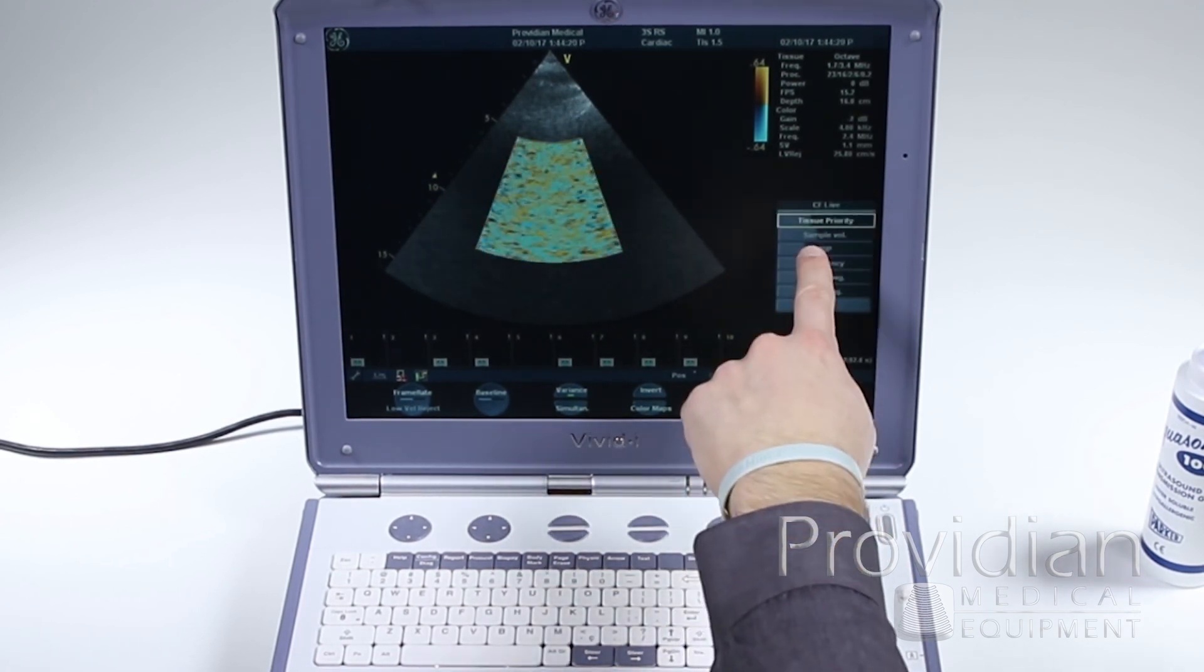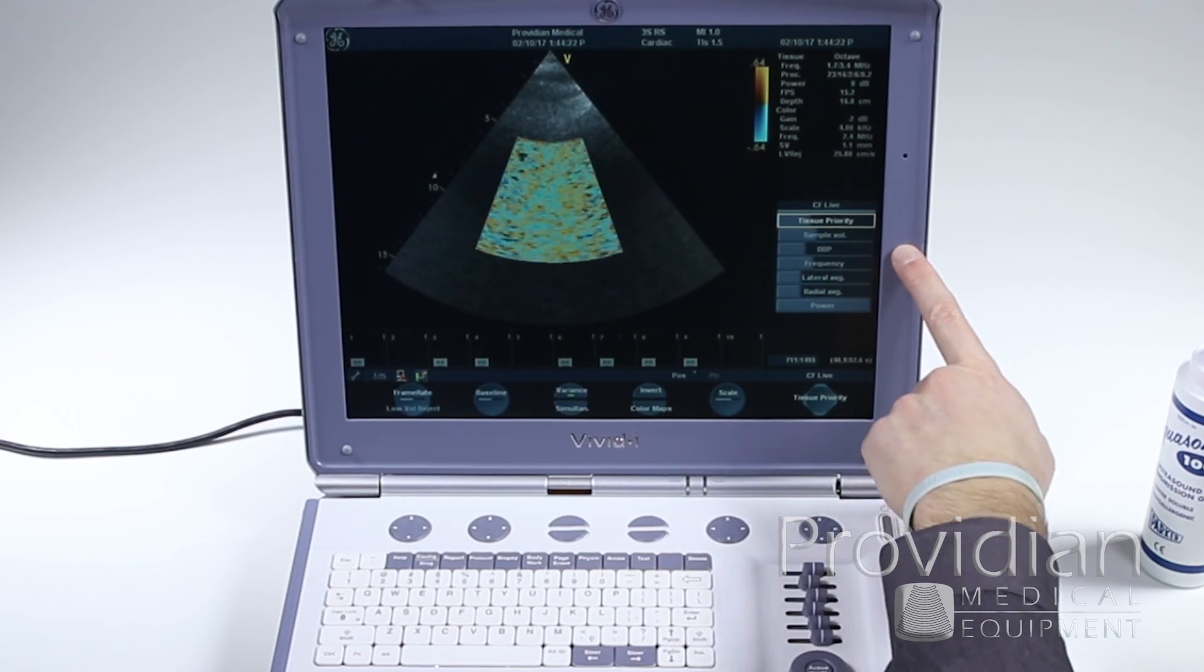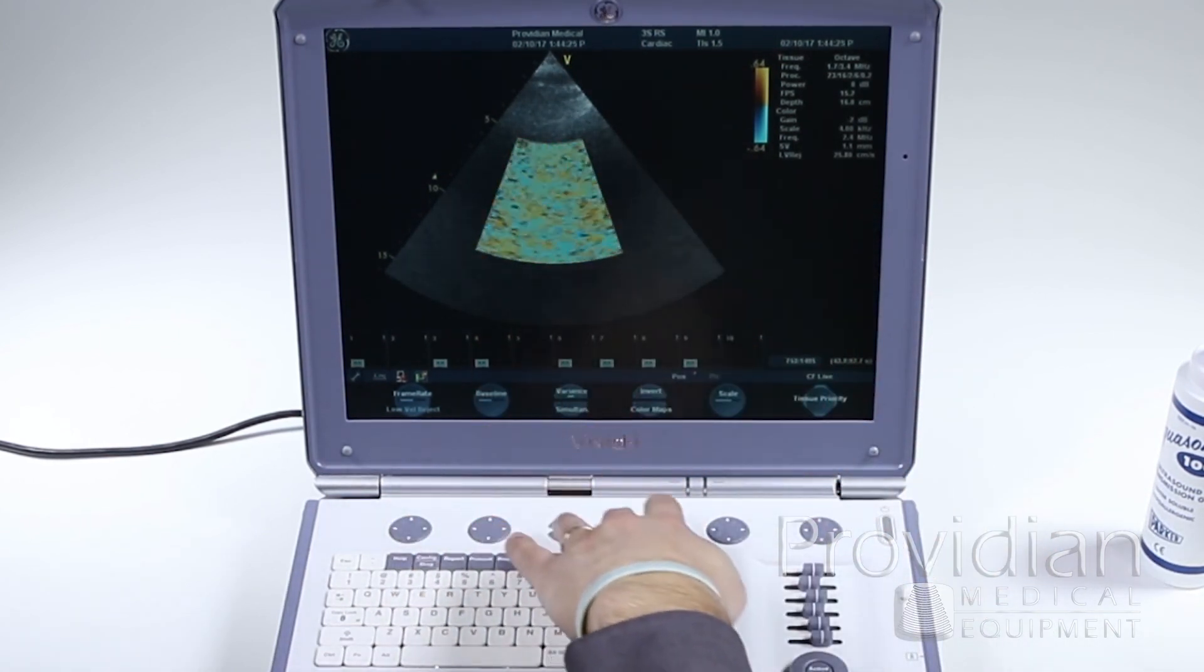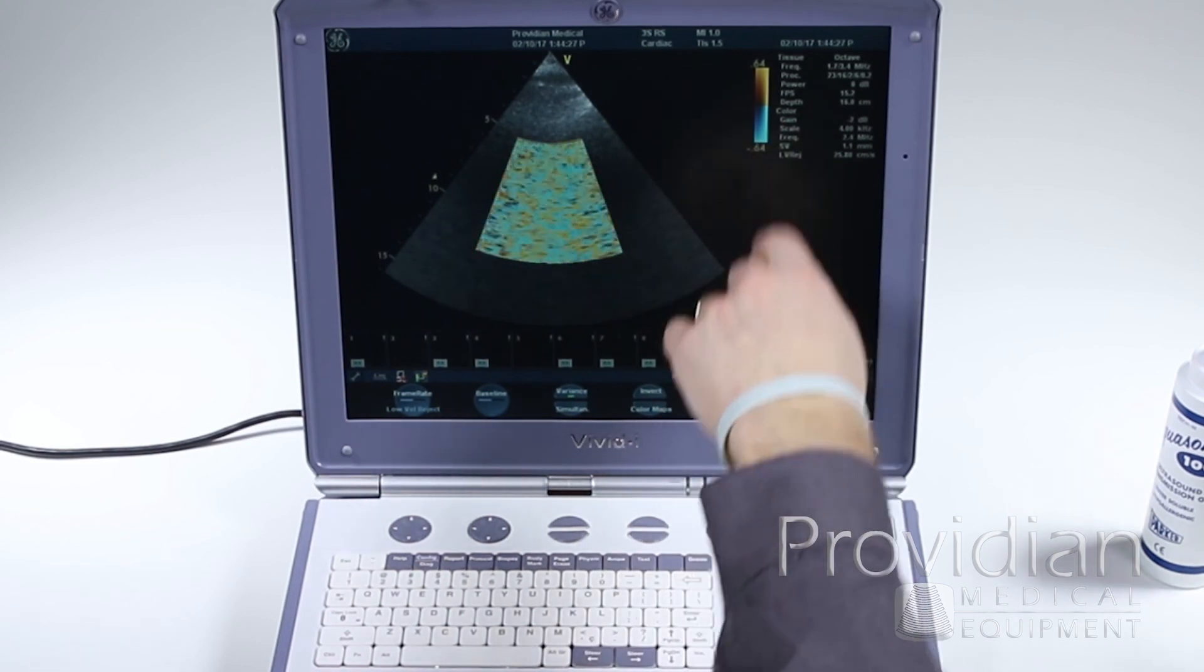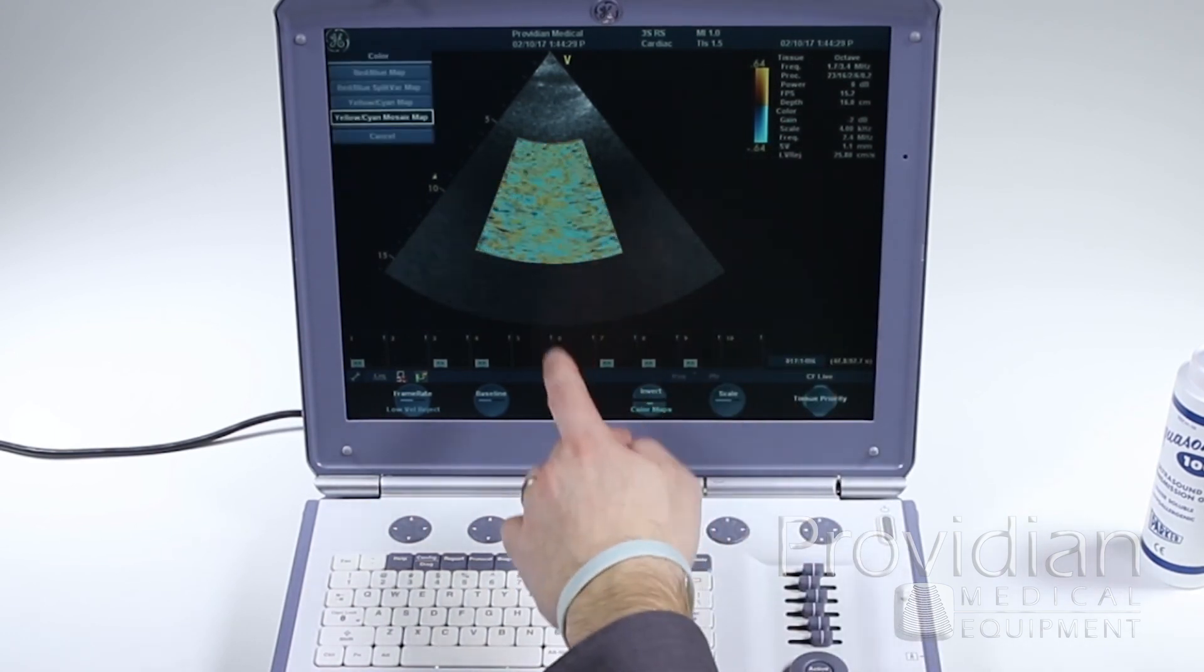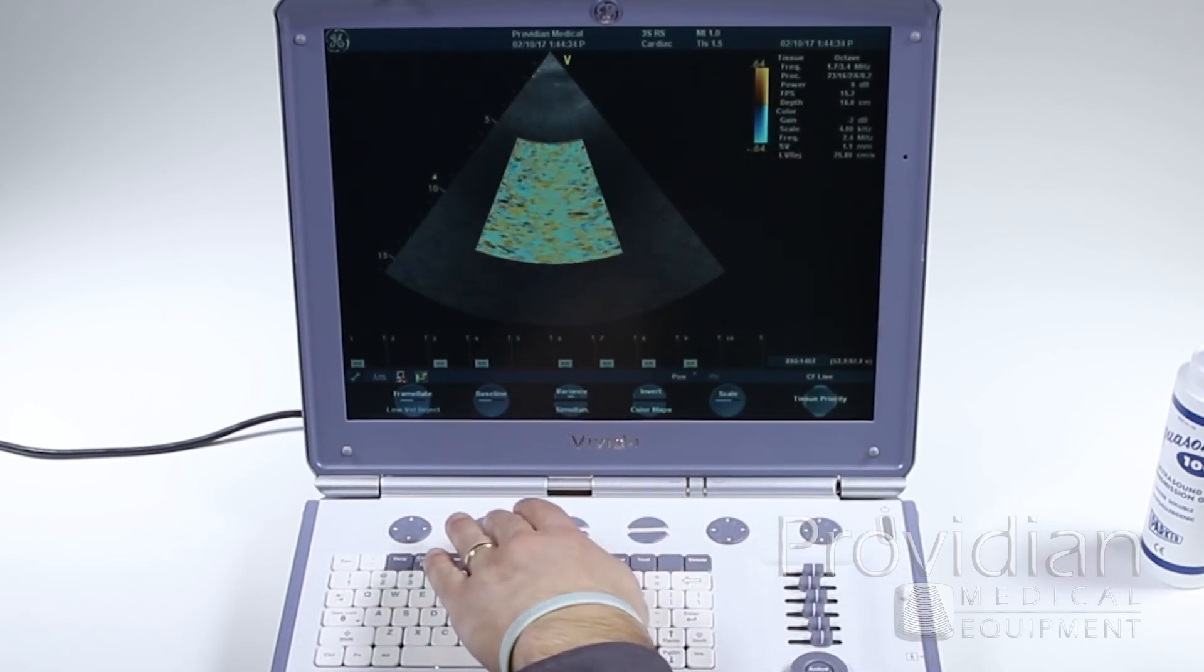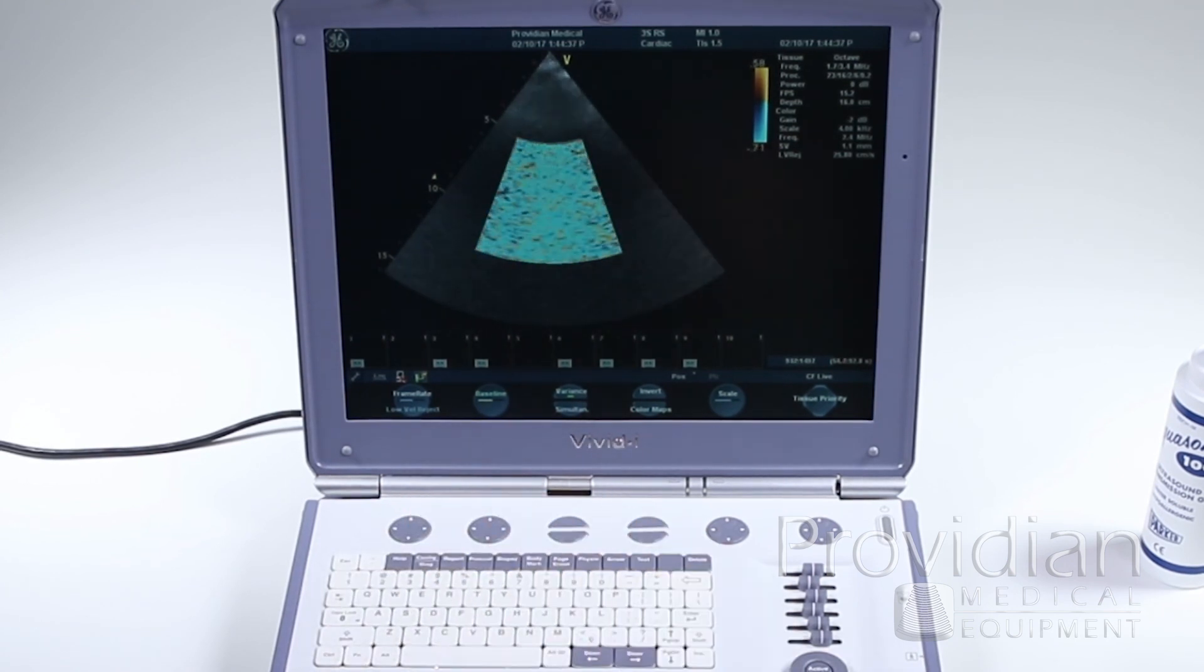Again, you have these hidden controls as well for sample volume, frequency, averaging power. Your scale is here. Your color maps, you can adjust those there. Change your baseline, etc.